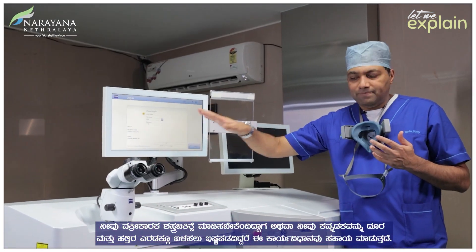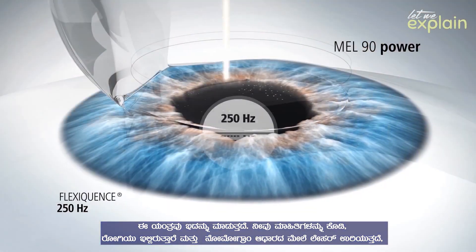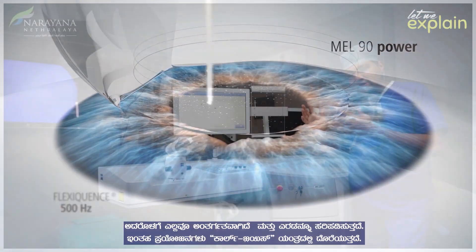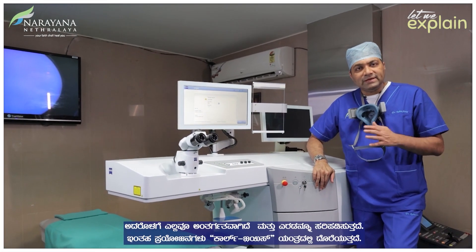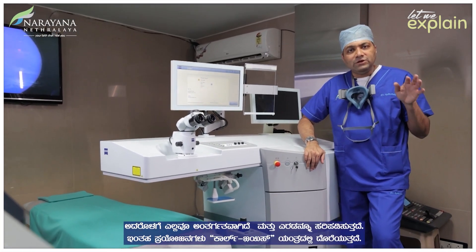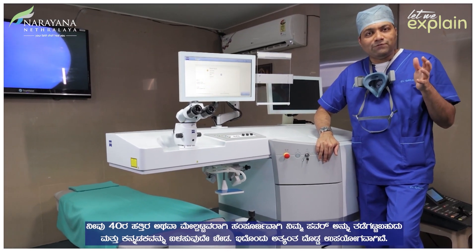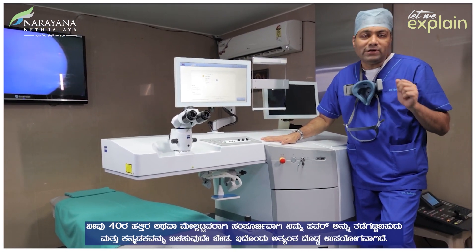You enter the data, the patient is here, and the laser fires based on the nomogram that is built in, and it can correct both. This is from Carl Zeiss. One of the biggest advantages of this machine is that you can completely knock your power off when you turn close to 40, or at 40 and above, so you don't have to wear glasses at all.